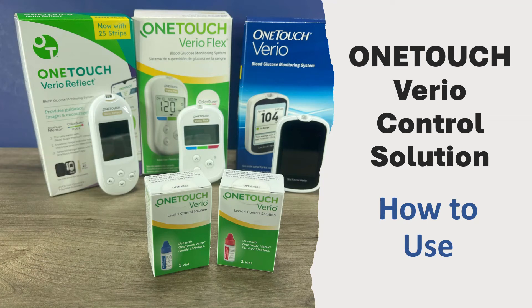Hi, this is Josh, pharmacist with Learn Blood Sugar Testing. I'm going to talk about OneTouch Verio Control Solution, what it is, and when to use it. I will also demonstrate how to use it for each of the three meters shown here — the Verio Reflect, the Verio Flex, as well as the regular OneTouch Verio.